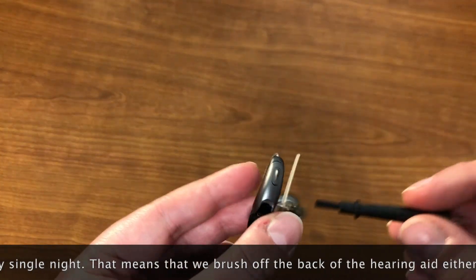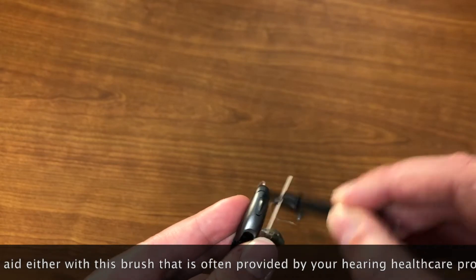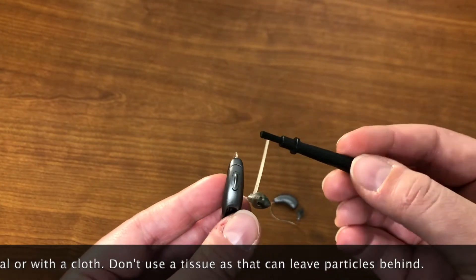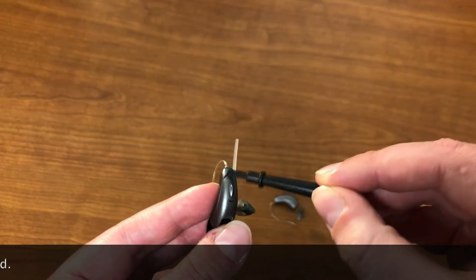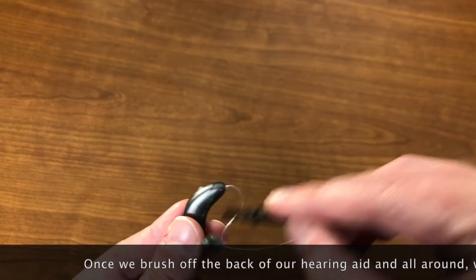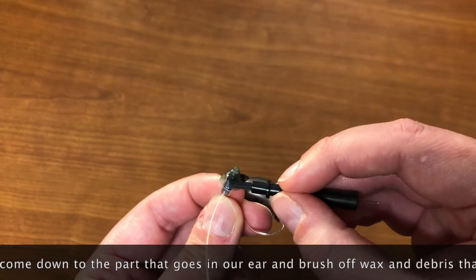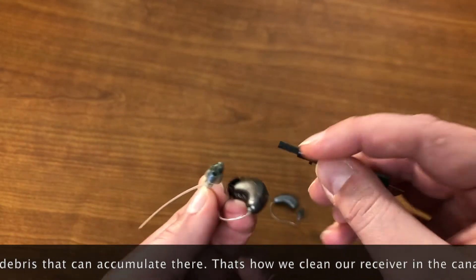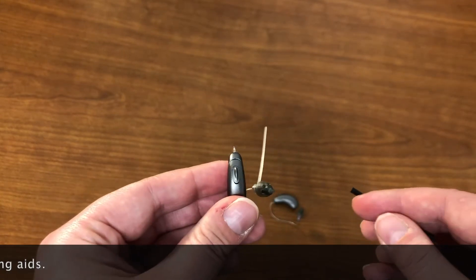That means that we brush off the back of the hearing aid. We can do this with this brush that's often provided by our hearing health care professional, or a plain cloth. Don't use any tissues because those can often leave particles behind. Once we brush off the back of our hearing aid and all around, we can come down to this part that goes in our ear and try to brush off any wax or debris that can accumulate there. And that's how we clean our receiver in the canal hearing aids.